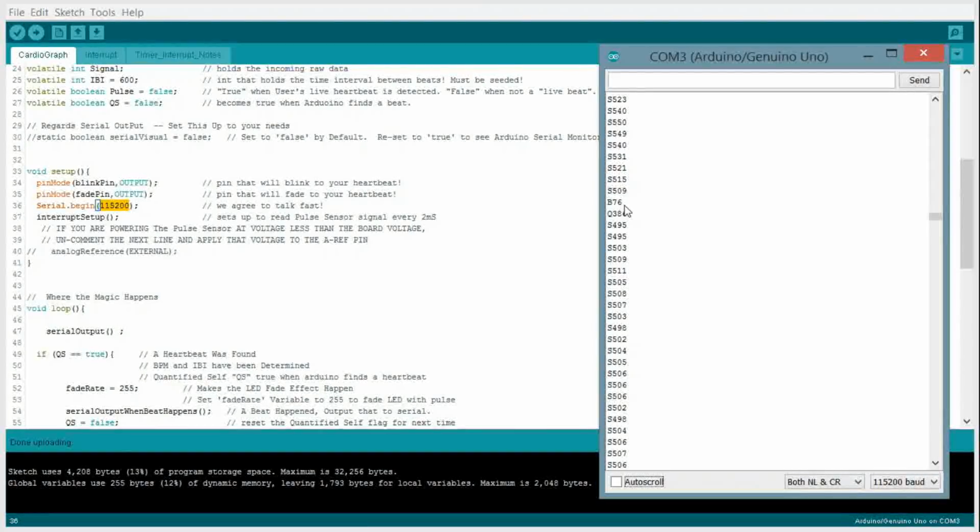And basically, I think that's just using a 10-beat average. It's just calculating the IBI, which you have down here. 386 is my interbeat interval. So it's calculating that information and sending it off. 386 is not a very good interval.